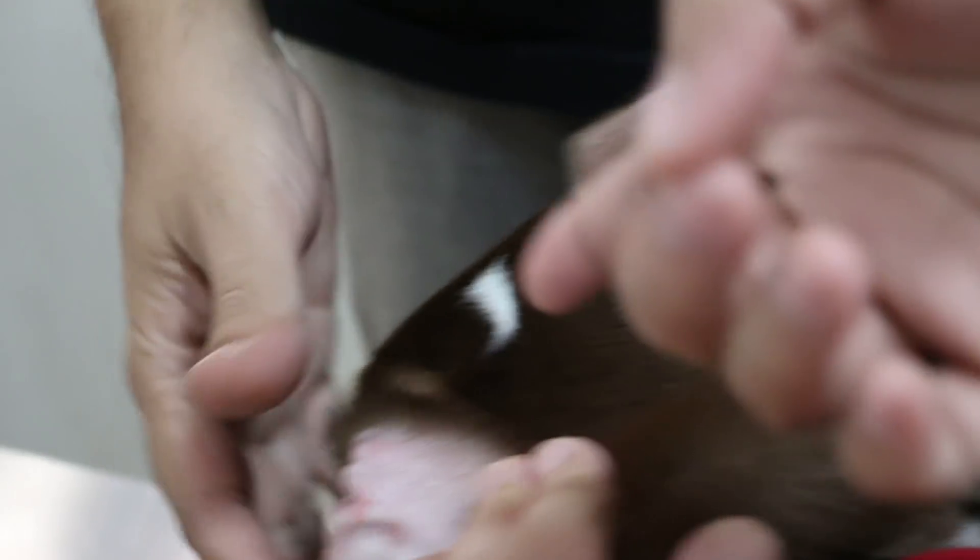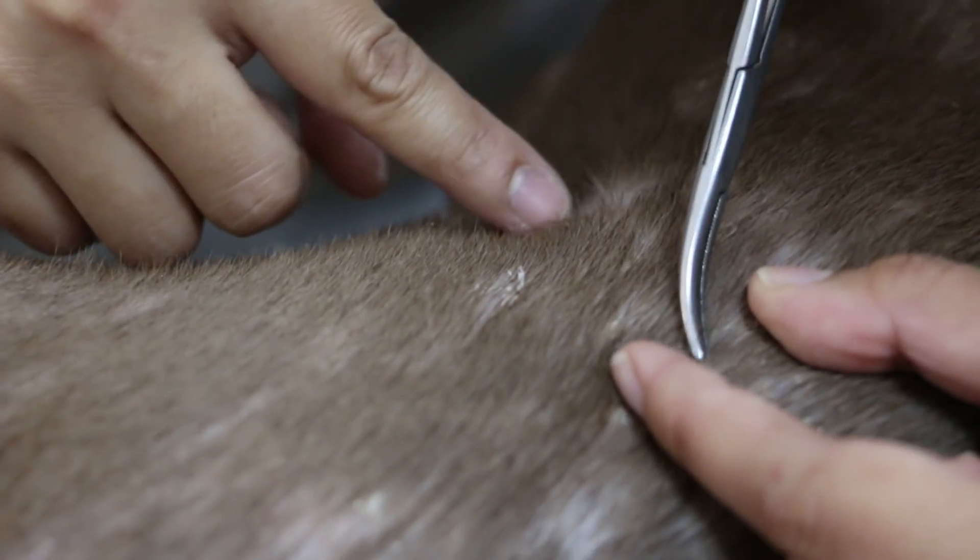Then turn to the other side. We need to get one from the ear — so from the ear as well. The one with a lot of rashes, this side. Oh, you got one more here first — there's still rashes there. Get a bit more. So we get different areas and follow the clock positions.